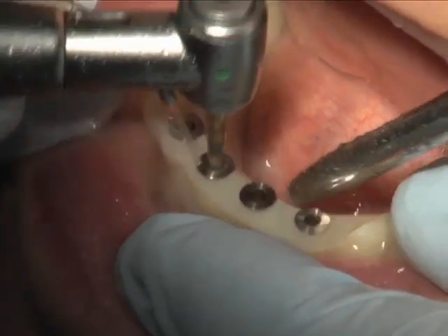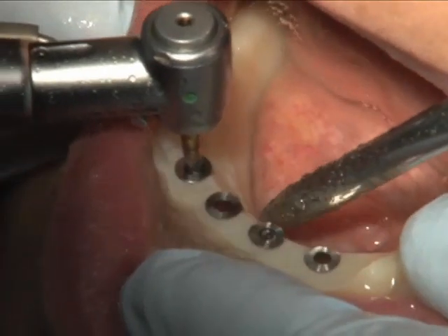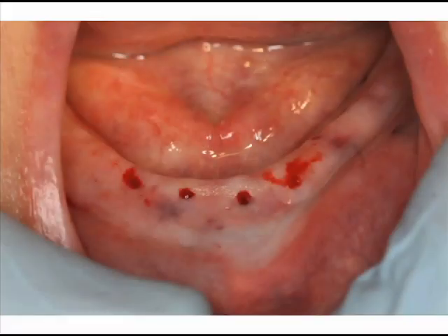Perforations were made through the soft tissue and through the crestal portion of the cortical ridge. This allowed for directional placement of the implants. Figure 17 shows how the tissue and cortical bone were perforated, which will allow us to directionally place our implants quite effectively and easily. Remember, this is a flapless procedure, so it's very, very atraumatic to the patient as opposed to a full thickness flap.